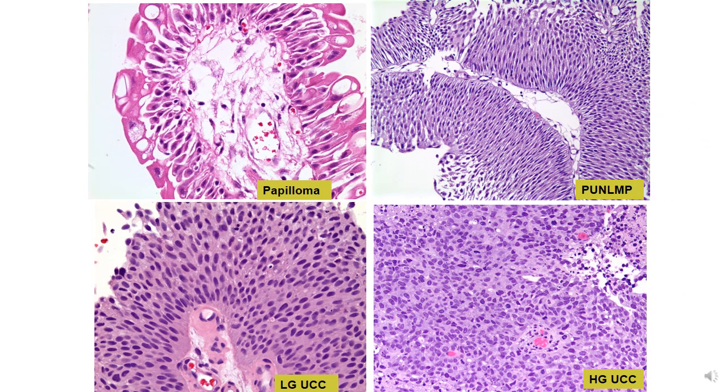So here are these four common papillary neoplastic processes based on 2016 WHO classification: papilloma, which has a normal urothelial lining with no architectural or cytological atypia. You can have a hyperplastic but pretty much bland looking cytological process, which is referred to as a papillary urothelial neoplasm of low malignant potential. And then you could be dealing with a low grade papillary urothelial carcinoma and a high grade process. And we will talk about how to distinguish low from high grade in subsequent sections.